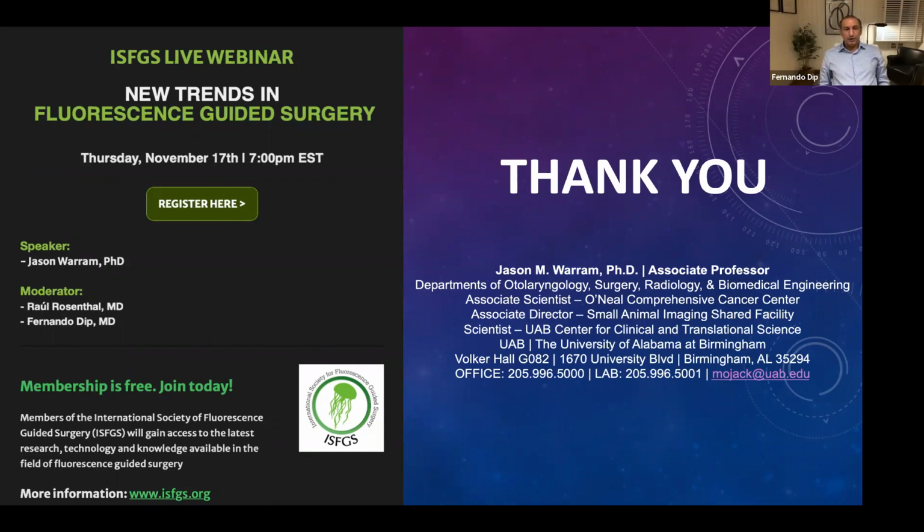Yeah, thank you very much. And in our practice, every time that we're going to start using a new technology, one of the things that we really need to know is how safe the new technology is. When we started using ICG, indocyanine green, which was approved in 1959, the adverse effect of the dye is really very low, and this makes it much easier to start using a new technology. So my question to you is, when we start studying these dyes, what's the evidence? How safe are they in comparison with ICG or with other dyes that we may use?